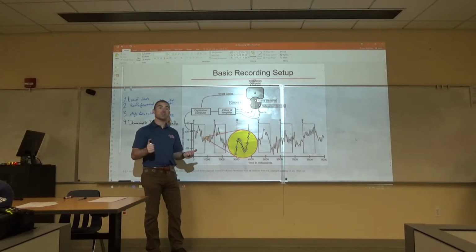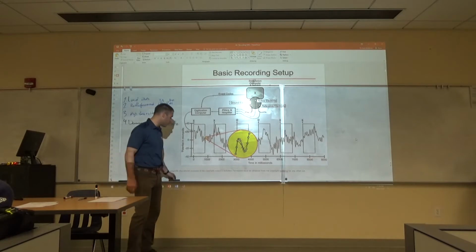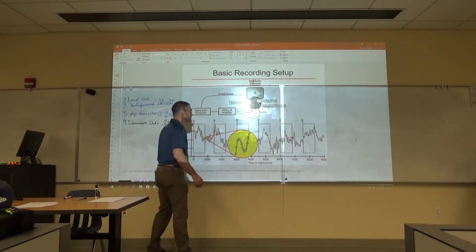So we're going to be changing our sampling rate. 256 is still a really good sampling rate. It's perfectly fine. It's just going to make it a smaller file to work with. Makes it a lot more efficient. So that's the ideal for sample.